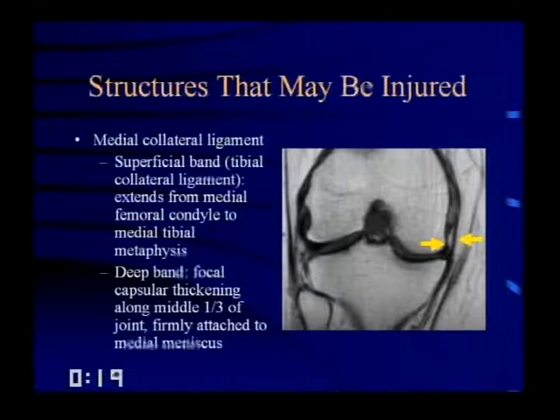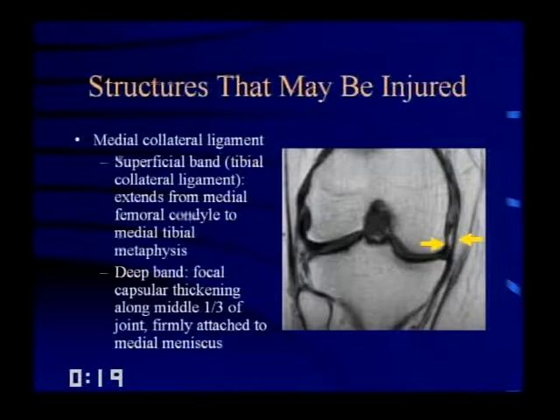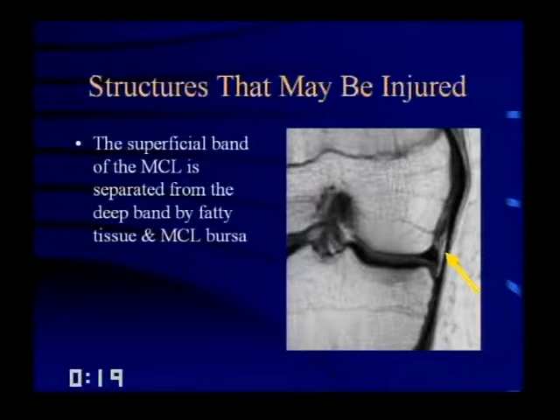The medial collateral ligament has two components. The superficial band — the tibial collateral ligament — extends from the medial femoral condyle to the medial tibial metaphysis, sometimes off the field of view. The deep band is a focal capsular thickening along the middle third of the joint, firmly attached to the medial meniscus. Between the two there's a fibro-fatty bursa separating the superficial from the deep band of the MCL. The deep band can be very tough to visualize.